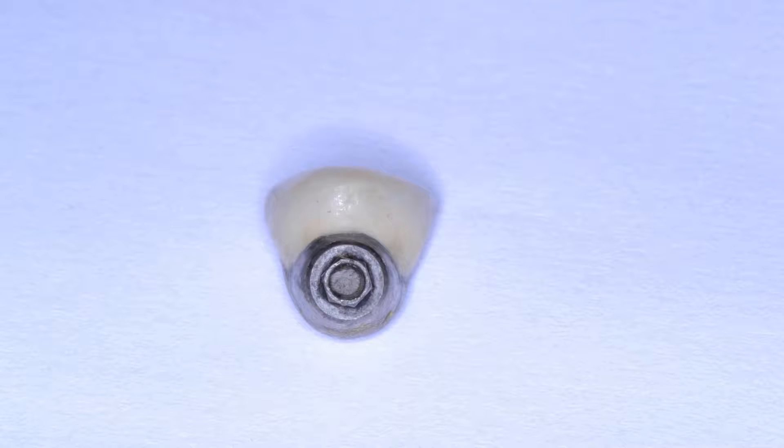Nonetheless, many times we are limited by the foundation or the bone when placing the implant, so even in my own professional career I've had to place cemented crowns in patients. As you can see here, the screw has basically broken off at the juncture of this internal hex with the implant facing. One of the nice things about internal hex implants is that they're a lot easier to remove screws from compared to trying to remove a broken screw from an external hex implant.